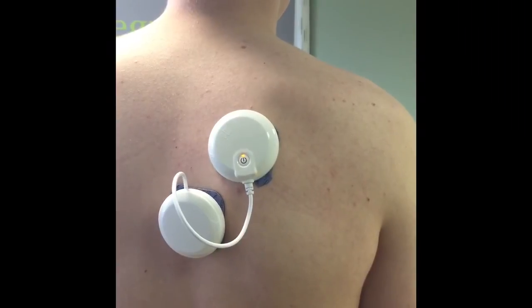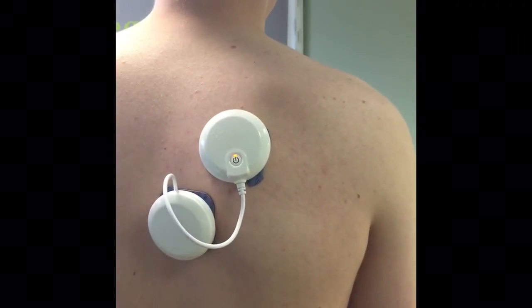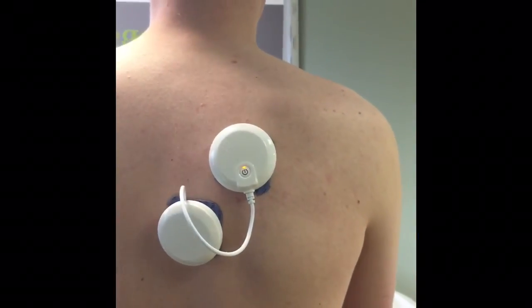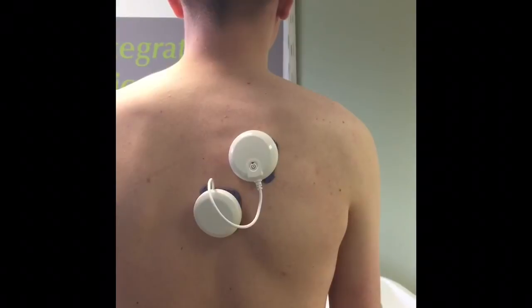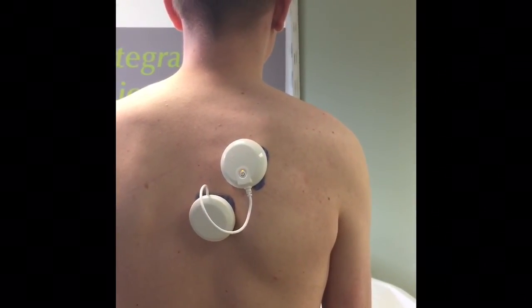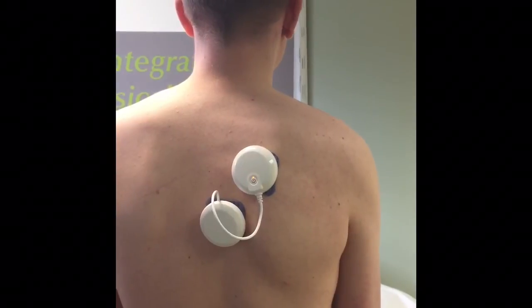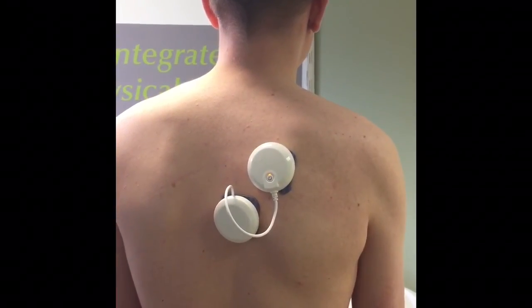And that's your workout done automatically. What we can also do is get Joe to work pulling against me again — so you remember before when he pulled his arm against me he overused his muscles at the front — now when he's pulling against me while the machine's contracting, his shoulder stays much more stable. There's still other work to be done, but this is a good starting point for most rehab.